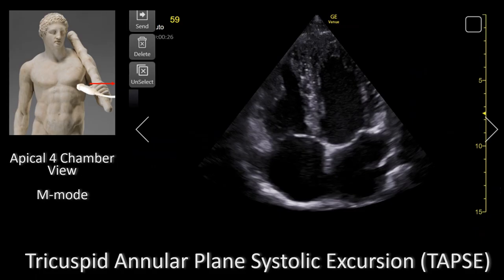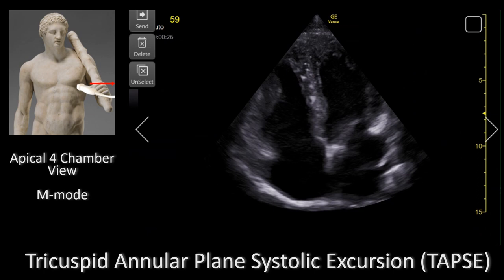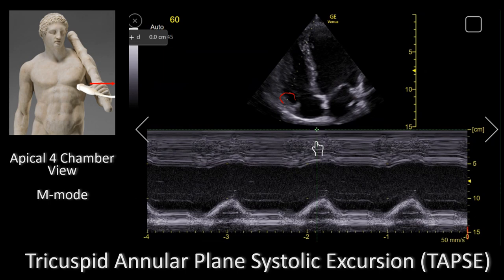Let's talk about how you get TAPSI measurements. First you will need a good apical 4-chamber view, and then you select M-mode on your echo machine. You place the M-mode cursor through the tricuspid annulus, which is right here, so the M-mode cursor would come just like that.